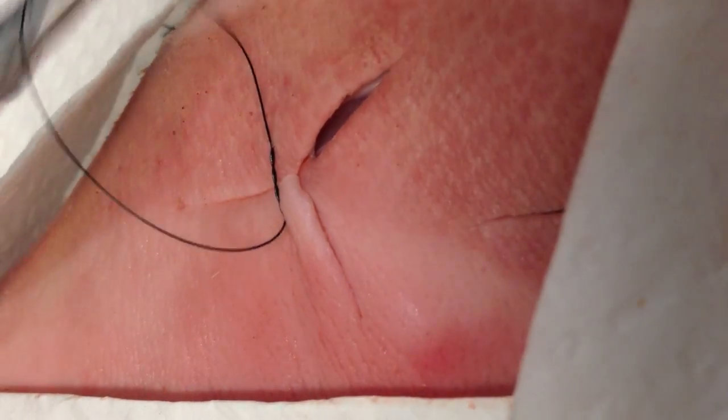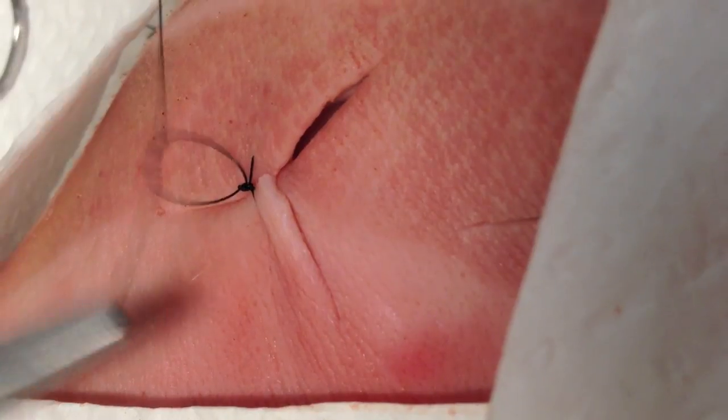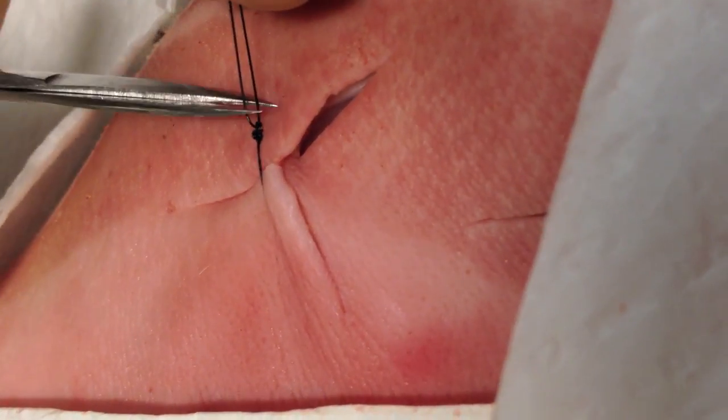What this does is help you approximate the edges of the stellate wound so you can now begin your repair of the laceration with simple interrupted sutures, or however you're planning to complete the closure, with your landmarks all preserved.